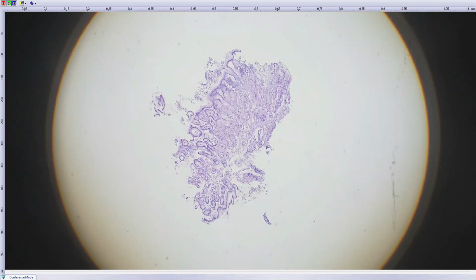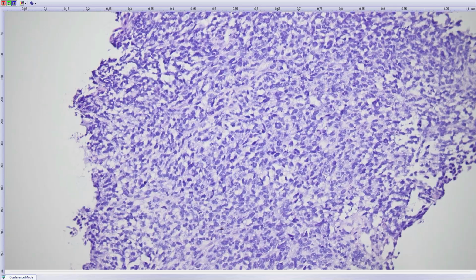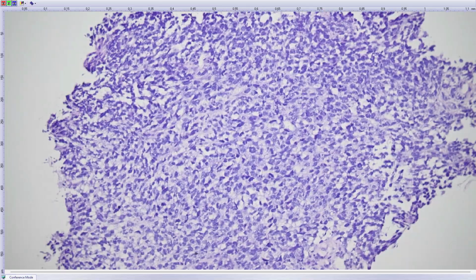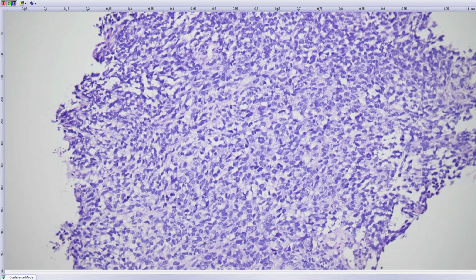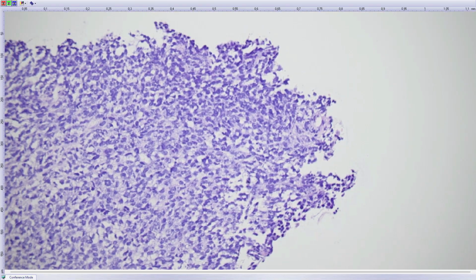I have one more slide, I believe. Looks similar. Any ideas what this could be? Or any differential diagnosis? Okay, maybe this is better. High-grade lymphoma or something. Okay, yes, high-grade lymphoma definitely should be in the broader differential, although this doesn't look really round cell, uniform, but definitely would not be a mistake to do some CD45 or something like that. Other markers you would do? Zahra, do you have suggestions? In the stomach, epithelial organ?